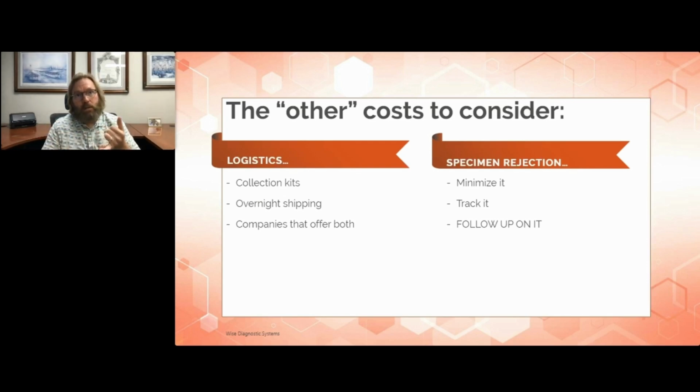One is, and this goes back to another slide, go off of data, not anecdotes. We track every single specimen rejection by testing type, and we also include in the notes what our common specimen rejections were. They could be anything from the fluid being poured out of the transport media to the swab not being left in the tube. We look at all those things and try to say, what are our most common problems that we can either address with clients or address within the lab itself.